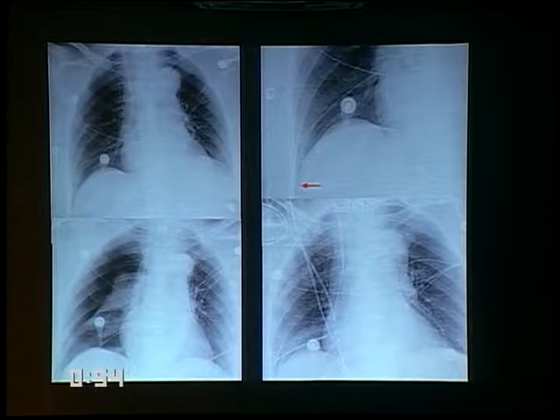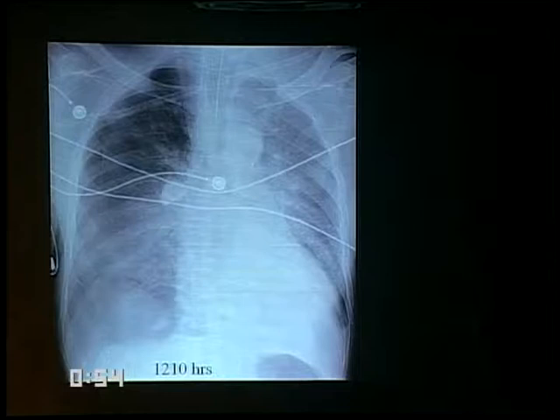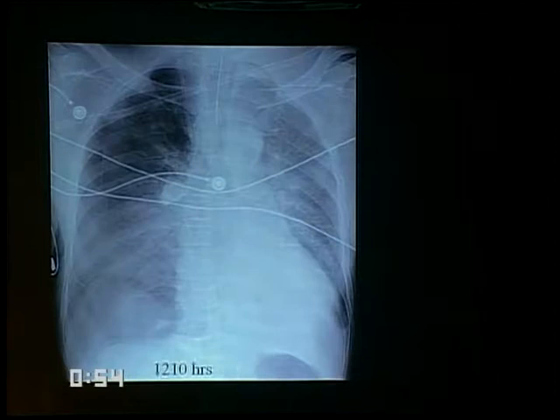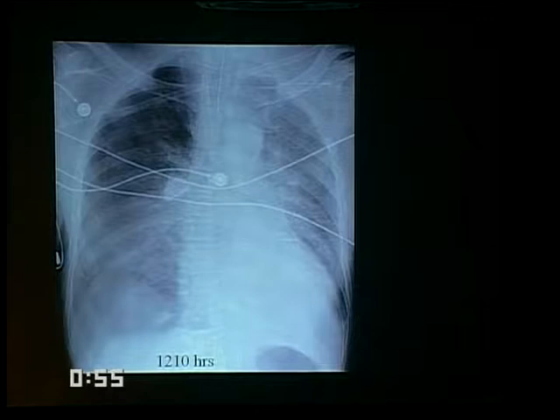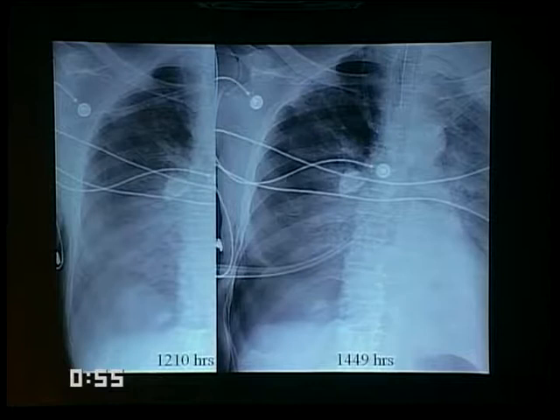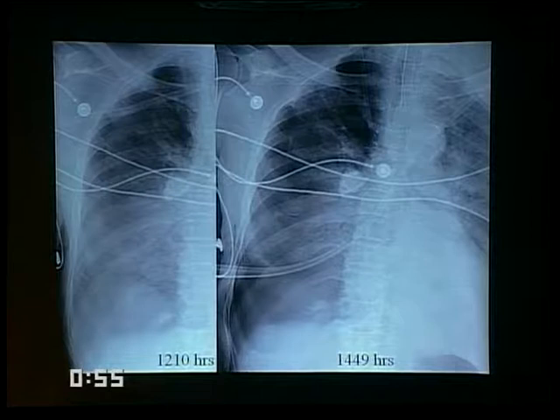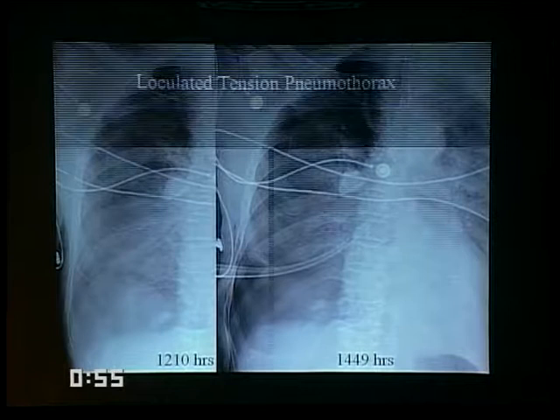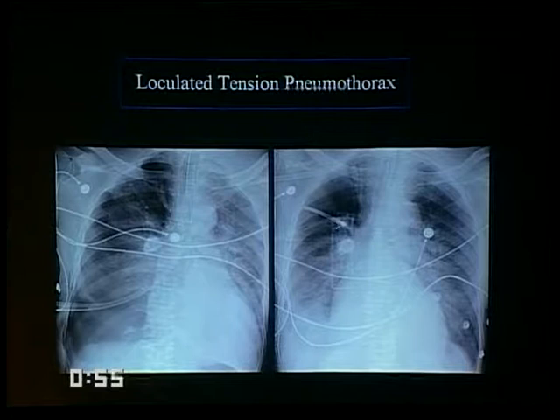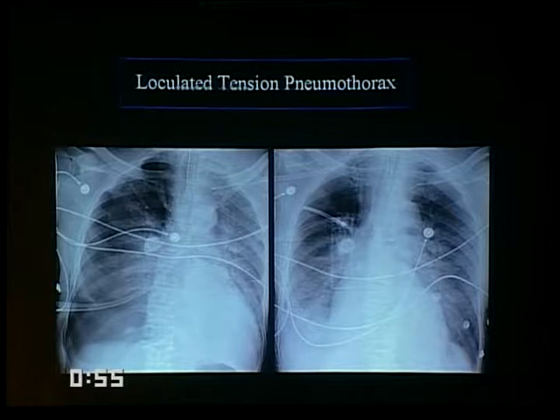The other way we can miss a pneumothorax is if it's loculated anteriorly — this is partly sub-pulmonic. Notice lung markings extending to the edge but there's just a lot of radiolucency, with shift of the mediastinum to the opposite side. This should alert us to the presence of a loculated anterior and sub-pulmonic pneumothorax. A later radiograph shows further extension — apparent pleural adhesions prevent the lung from retracting from the chest wall. Don't wait until you see air lateral to the lung if the patient has pleural adhesions. The chest tube pleurovac was inserted and the mediastinum returned to normal position.